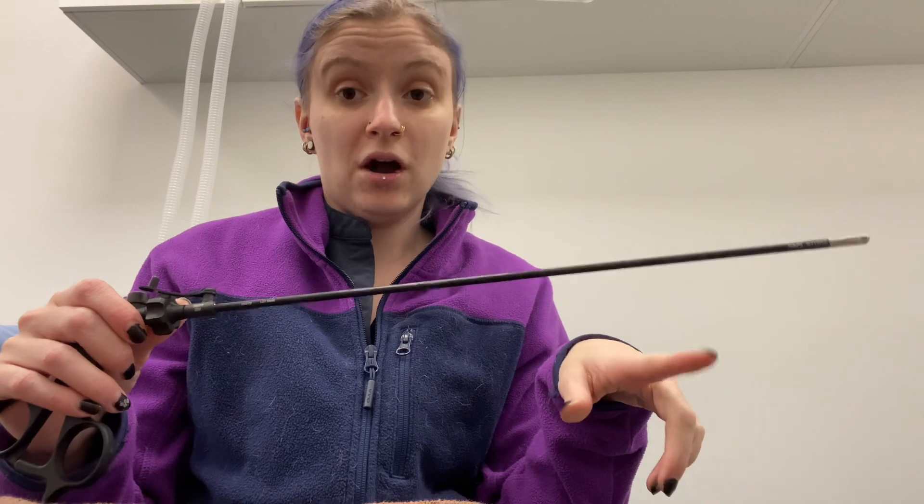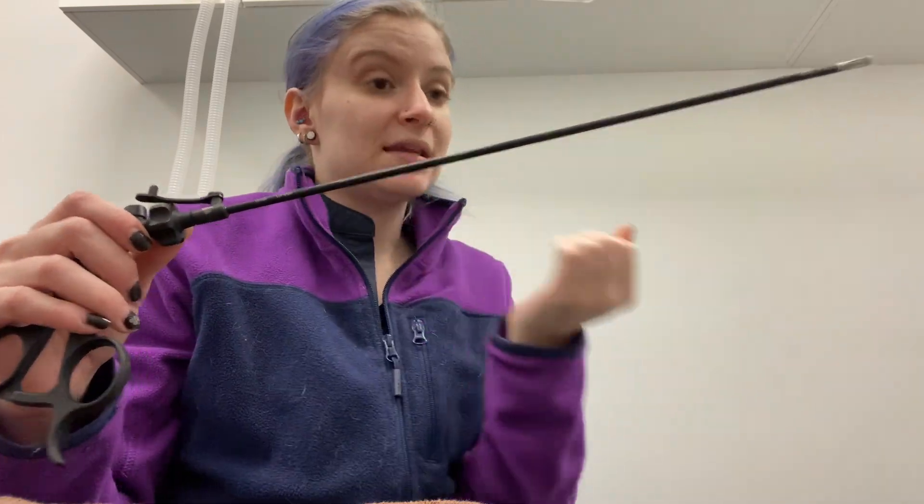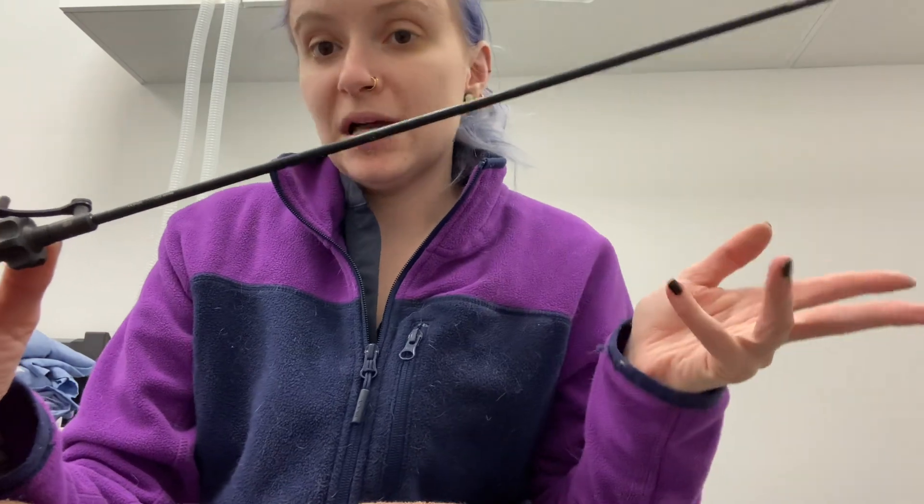This video is going to talk about assembling and disassembling a Storz either Babcock grasper or punch biopsy for laparoscopic surgery. This is the Storz click line with the Babcock handle — they're all assembled and disassembled the same way. These specific ones are able to go in water to clean them and they can go in the autoclave, which makes it nice and quick and easy. They don't have to be in plasma, but they can go in either plasma or the autoclave.